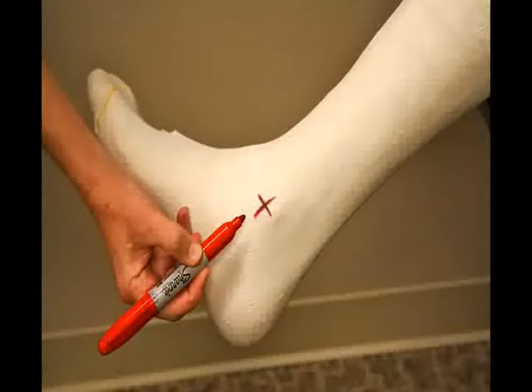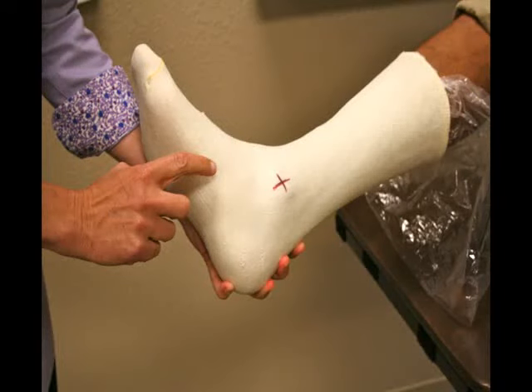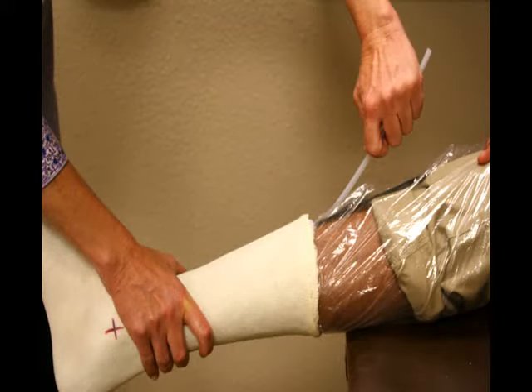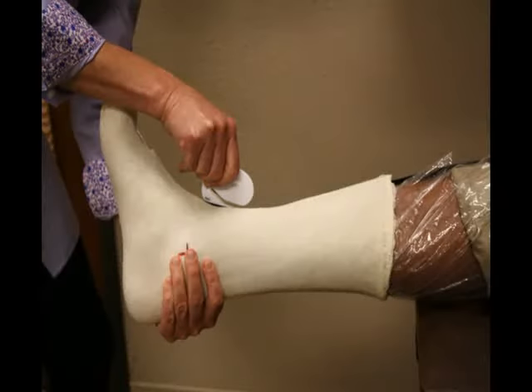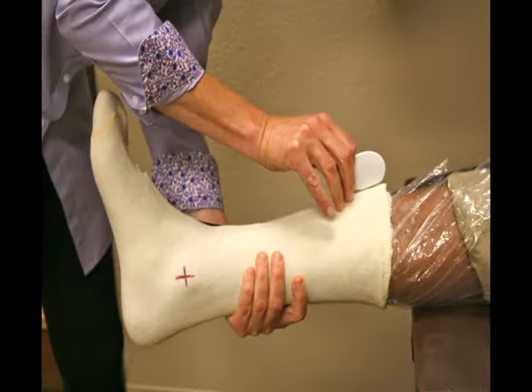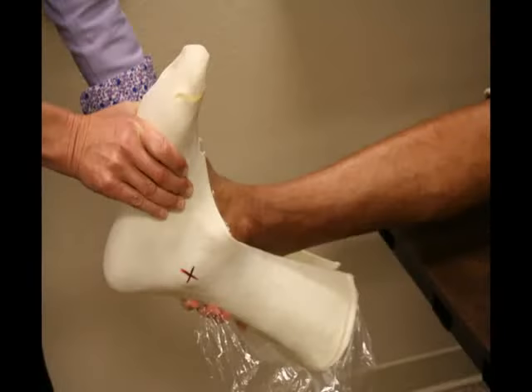Before removing the STS cast from the foot, be sure to mark the apex of both the medial and lateral malleoli. Tap the arch of the STS sock to make sure it is fully formed and rigid. Remove the tube from the proximal aspect of the cast by simply pulling. Insert the letter opener into the small area of incision that you've made previously. Move the opener to the anterior part of the ankle, exposing the dorsum of the foot, and then all the way up to the end of the cast at the tibial tuberosity. Open the cast to release the foot. Ask the patient to assist you in removing their foot, and do not worry about deforming the cast — it will go back to its original position.